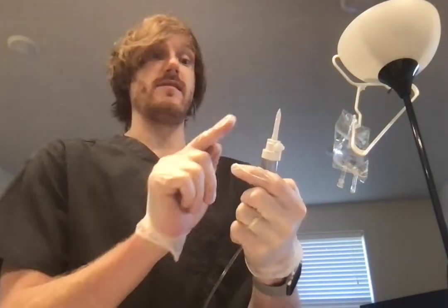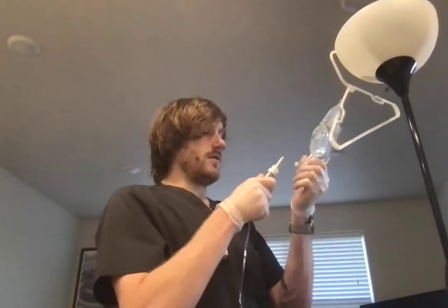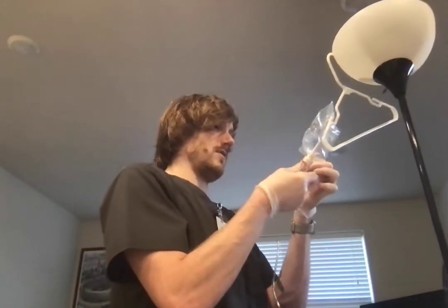And like I said, this is really sharp. If you're ever throwing these away and it's not attached to this, always put it in a sharps container or cut this part off. It's really, really sharp. Don't touch it. And so we'll go ahead and put this in here.